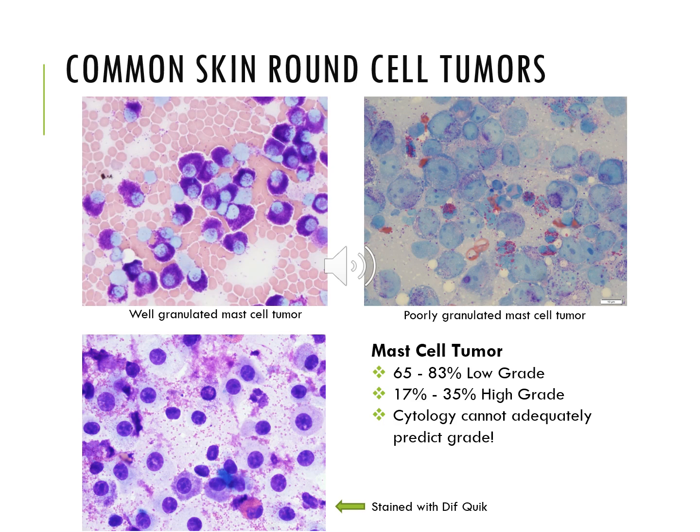Here in our ClinPath lab, we do not use the Diffquick stain. We use modified Wright stain or a Giemsa stain. And so that always stains the granules. But I know in practice, many of you will be using Diffquick. So I wanted to let you know that this can happen sometimes.